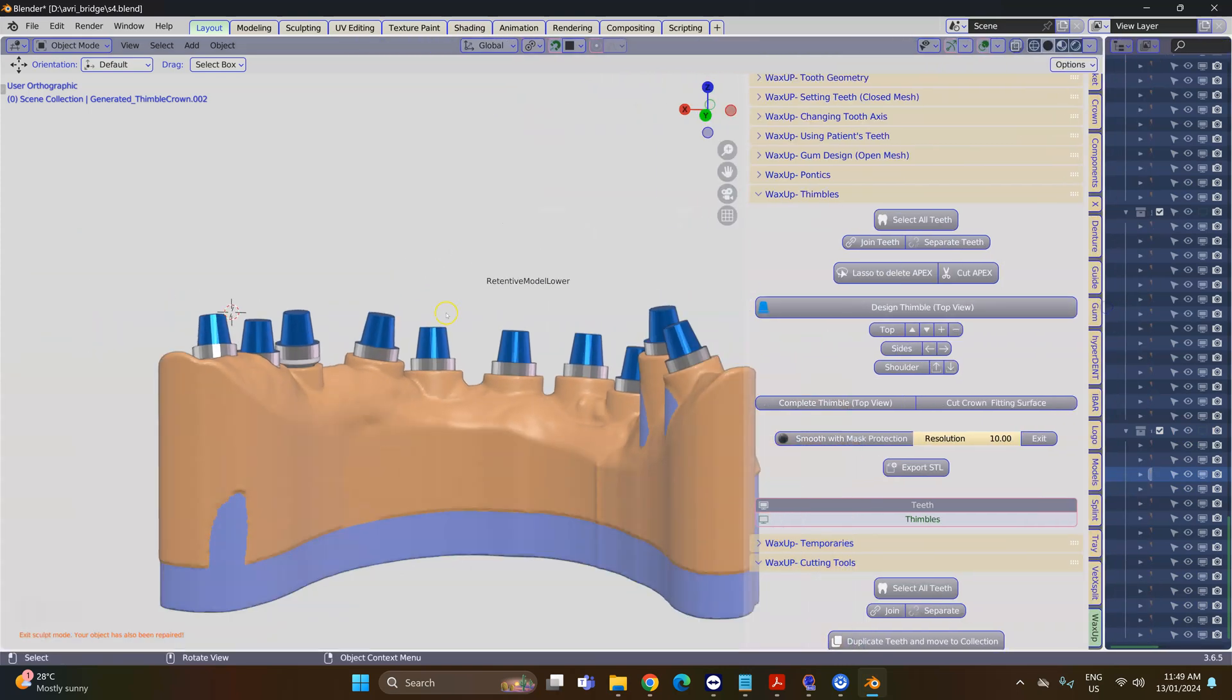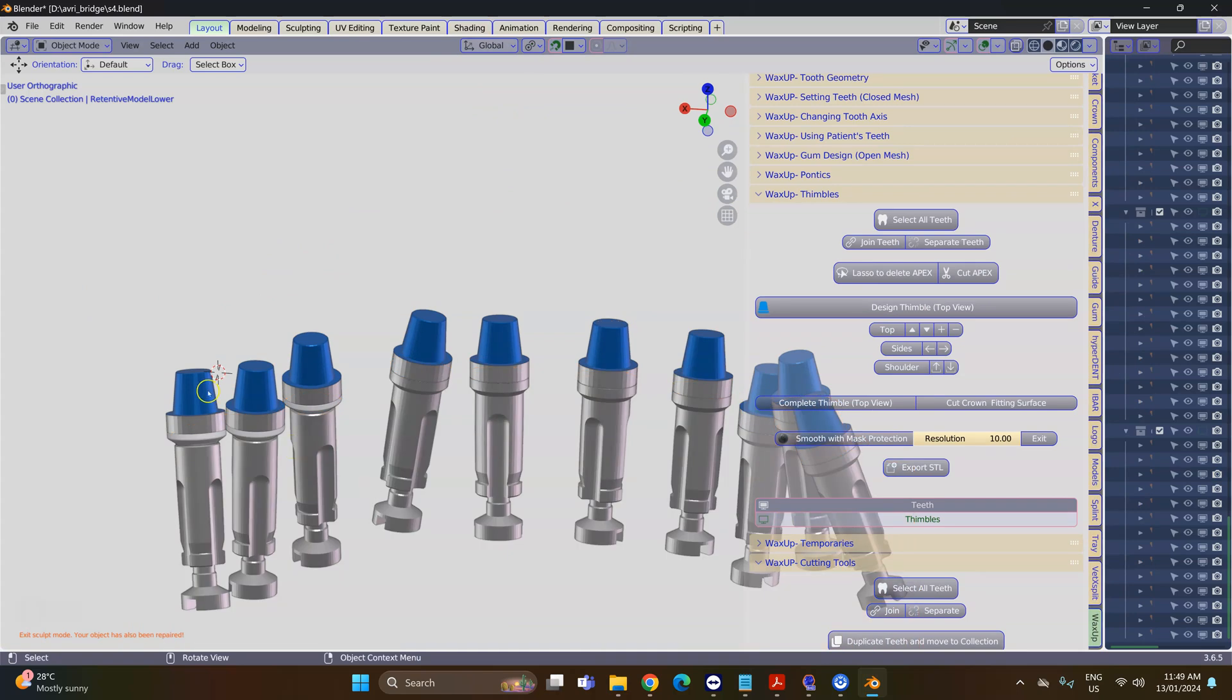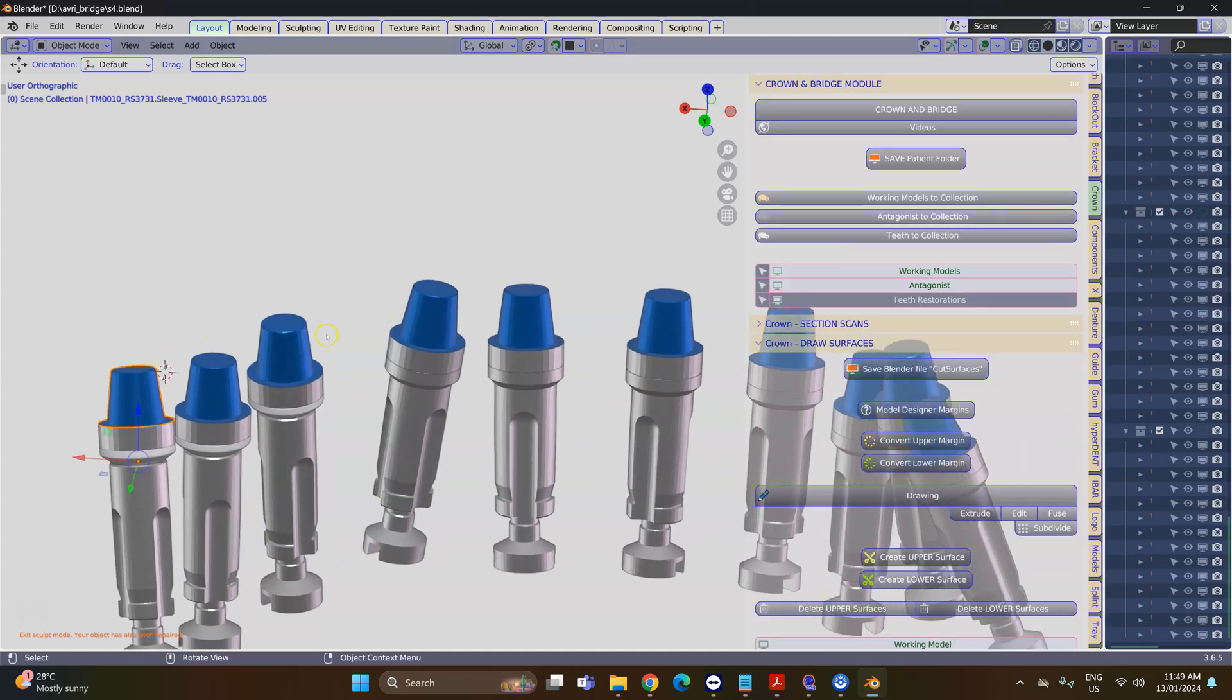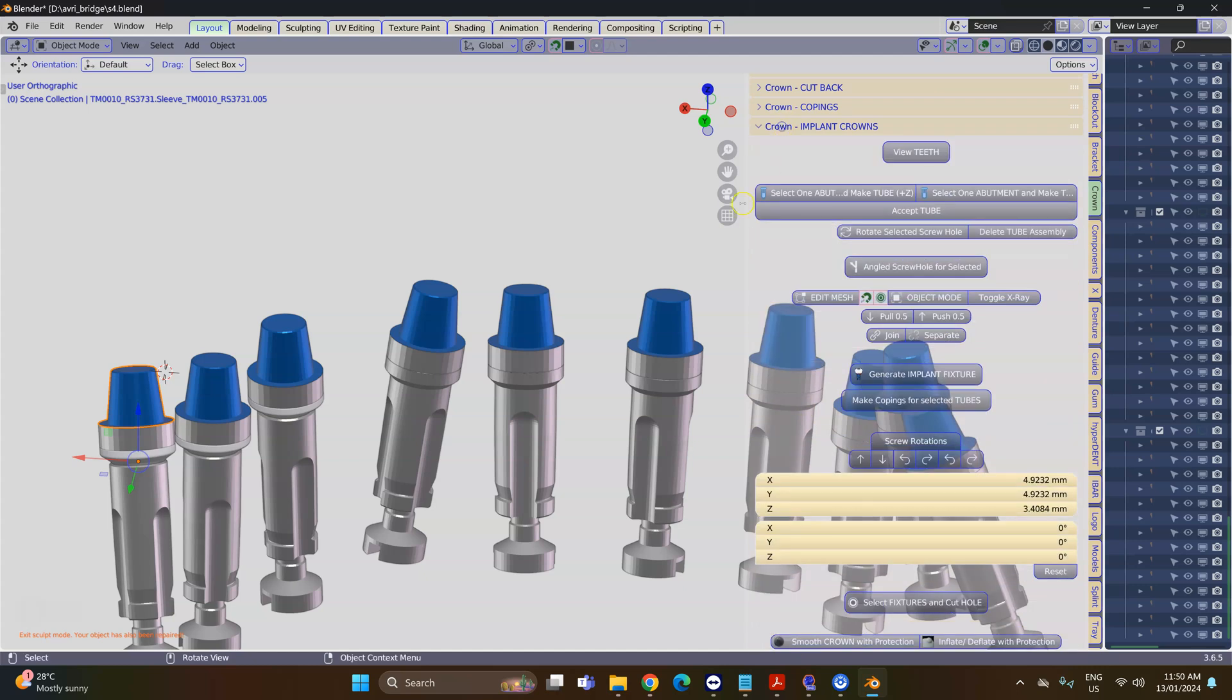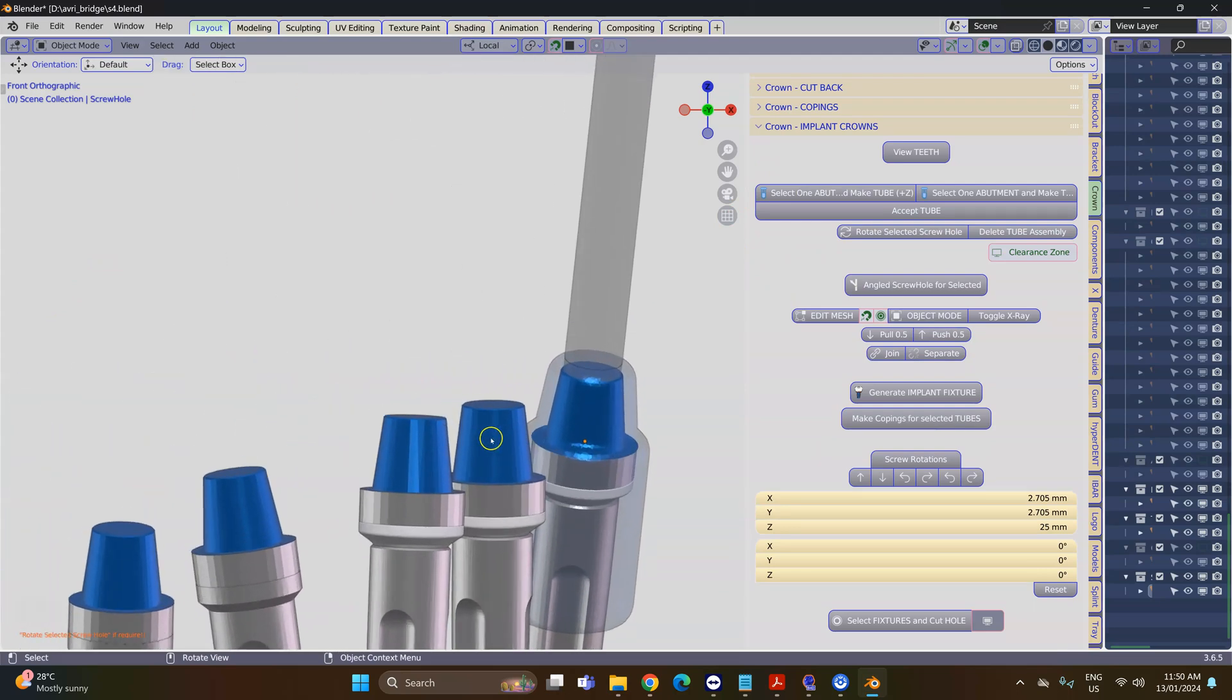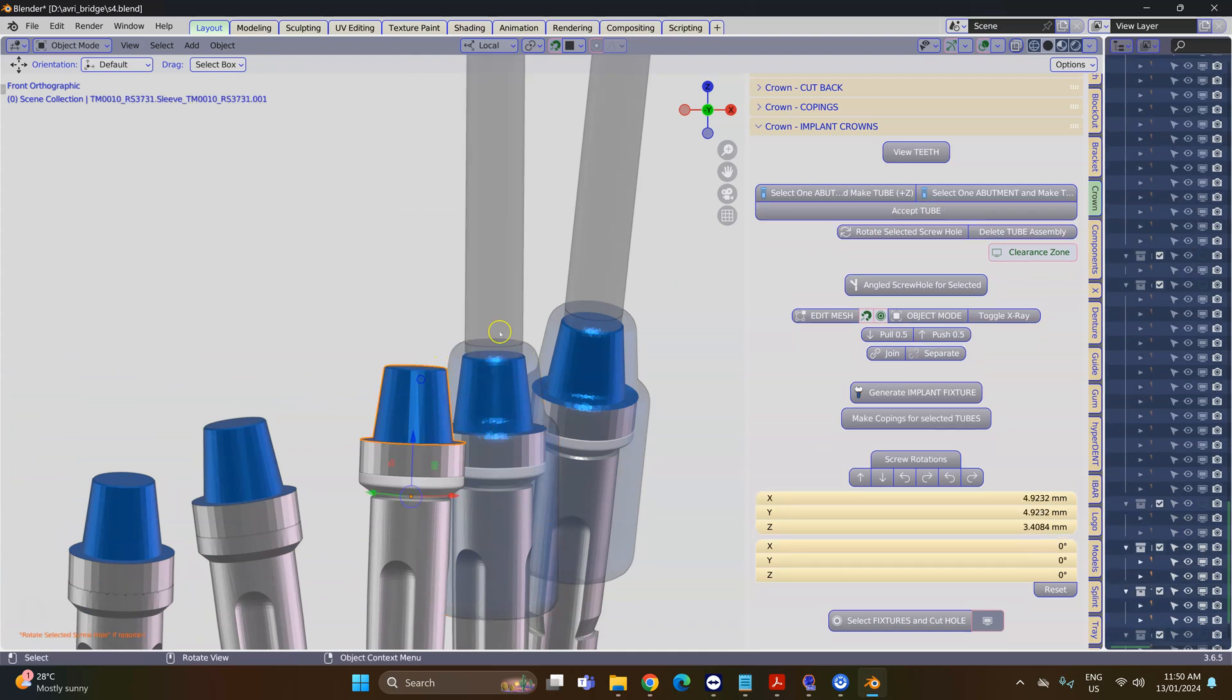Next we're going to create the necessary assemblies for these implants so that we can connect them to our hybrid eventually. Select each one of these interfaces and then go to the Crown module, make sure that you select the abutment and make a tube, then accept the tube. You're going to be doing this for each and every one of these implant interfaces.